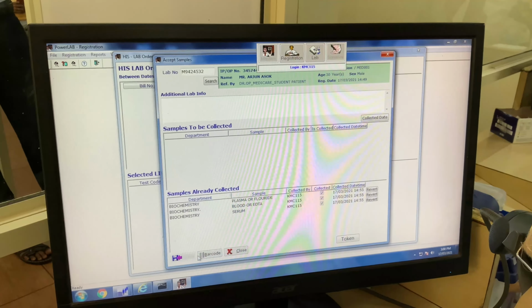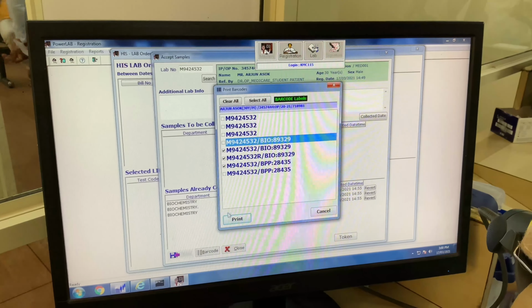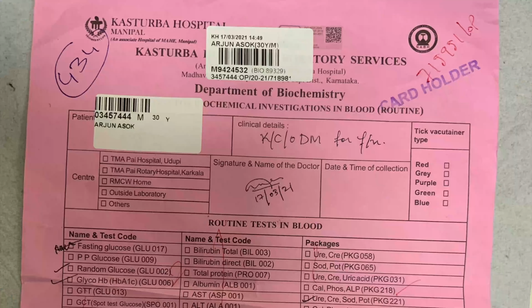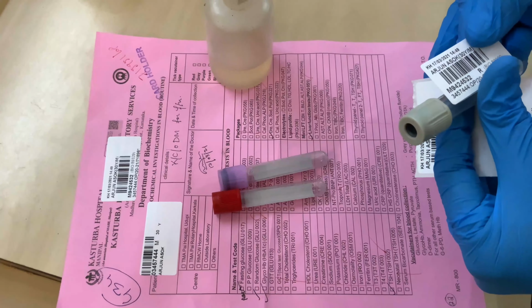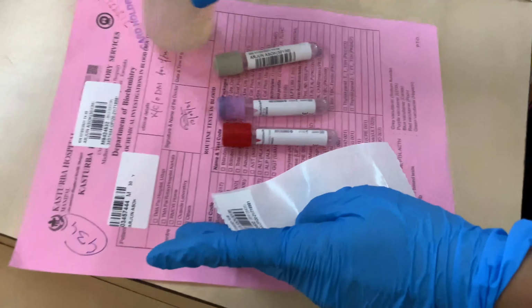In the sample collection center, the phlebotomist checks the requested tests and generates a barcode which has the details required for the autoanalyzer to perform the analysis on the samples given. The same barcodes are stuck on the vacutainers needed to collect blood for the relevant tests.